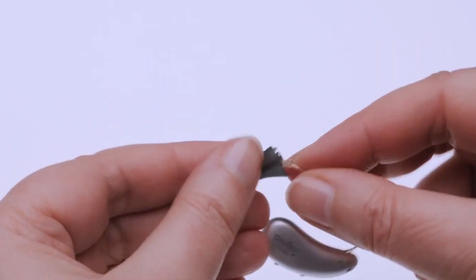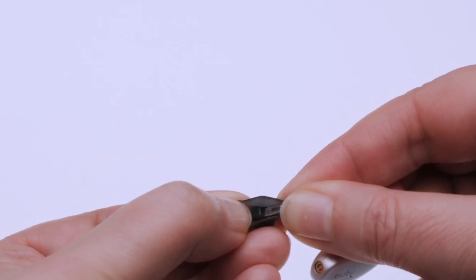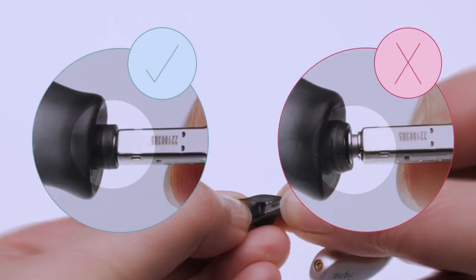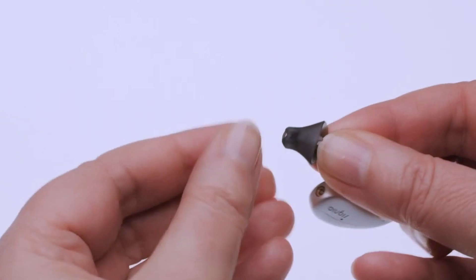When properly placed, you should not be able to see the notch when folding the dome away from the receiver. Try pushing the dome further onto the receiver if the notch is still exposed until it is completely covered.